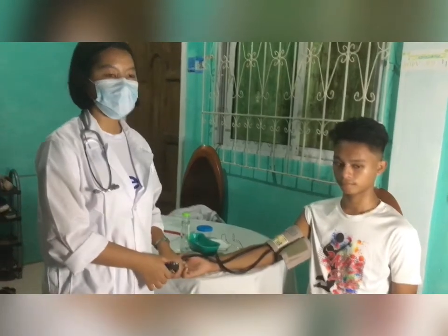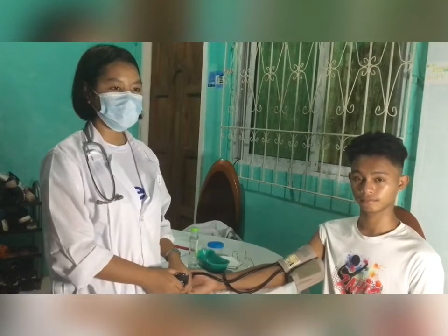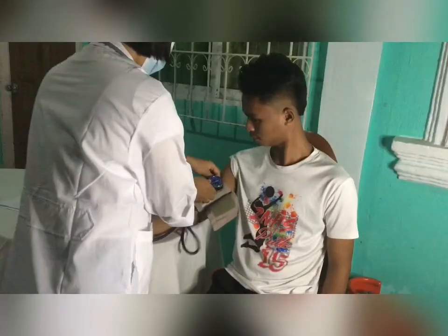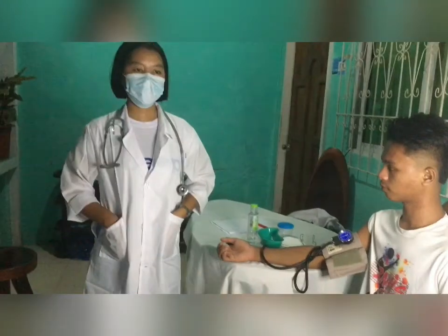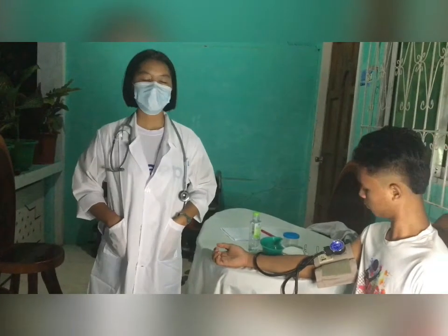Position yourself so that the manometer is vertically at eye level. Observation should not be farther than 1 meter. Insert the earpieces of the stethoscope in your ears so that they tilt slightly forward. Be sure sounds are clear, not muffled.